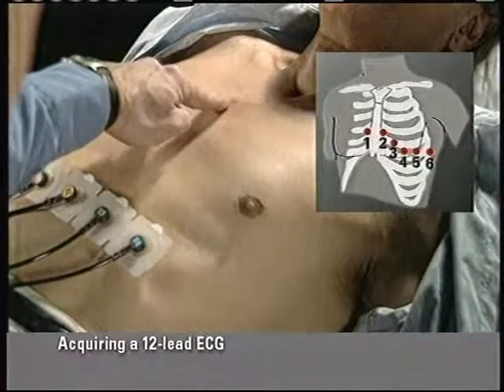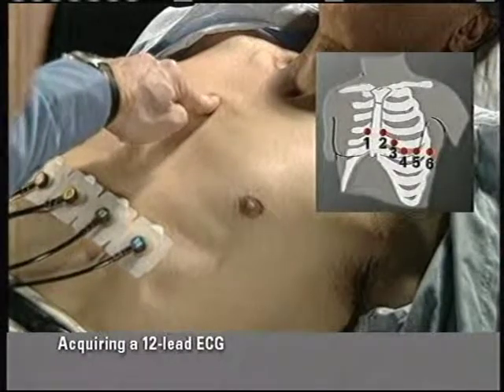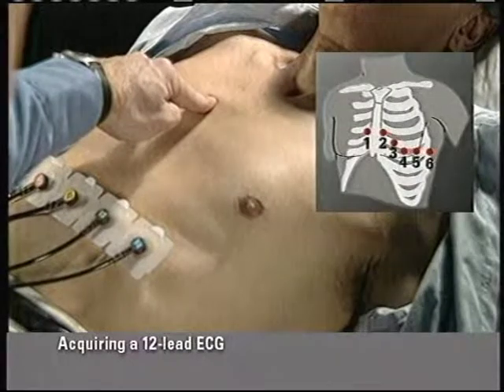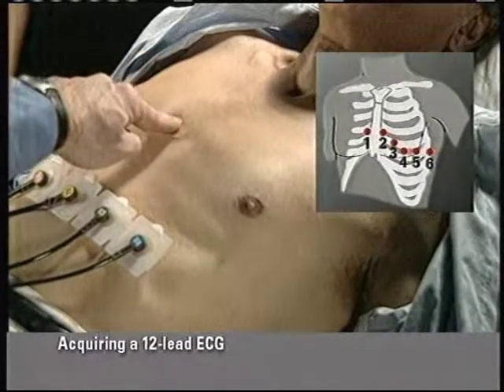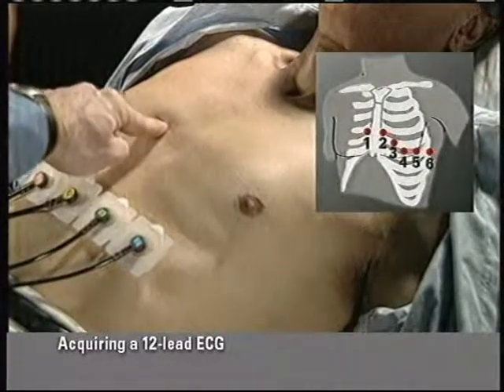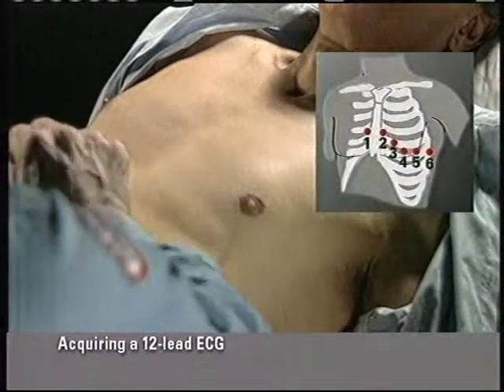Move your finger down and to the patient's right into the depression between the 2nd and 3rd ribs. This is the 2nd intercostal space. Move your finger down the right side of the sternum 2 more spaces. You have located the 4th intercostal space. Apply the V1 electrode.